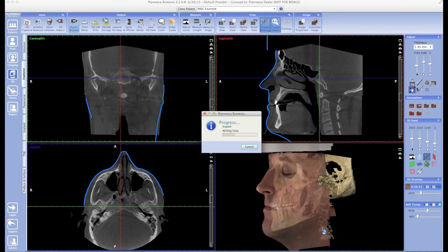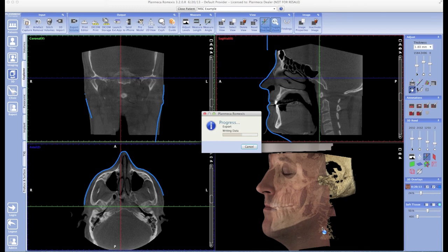The user could put it into their computer and double-click the Romexis viewer icon in the thumb drive, and they would be able to view that 3D volume.